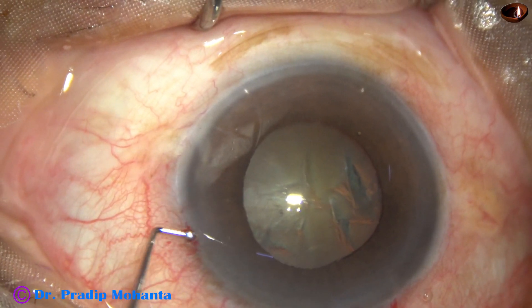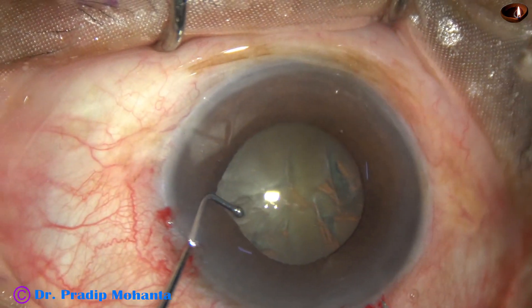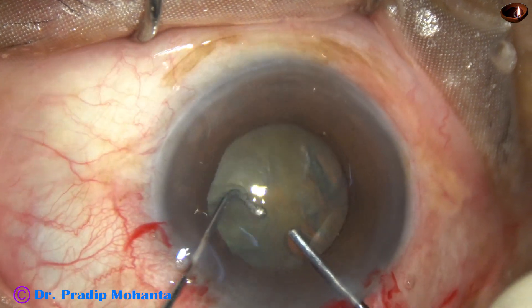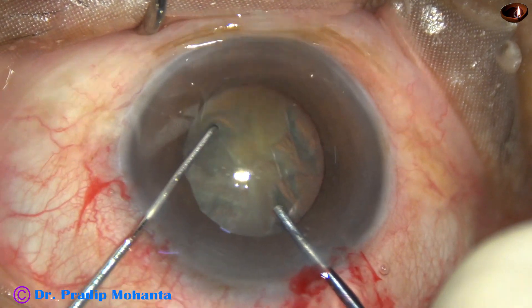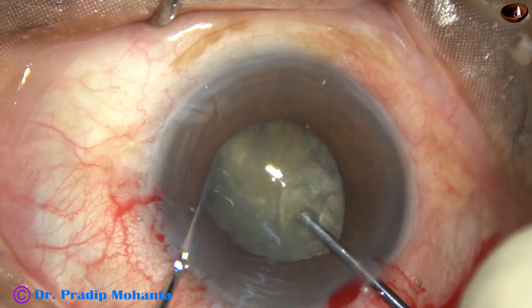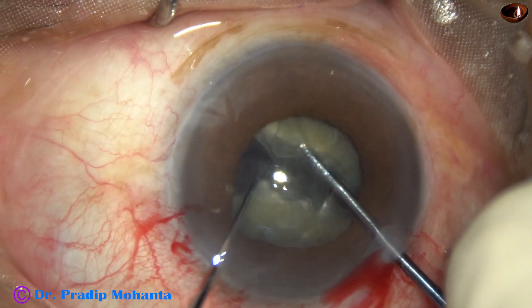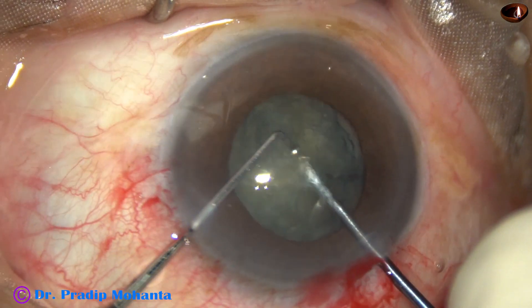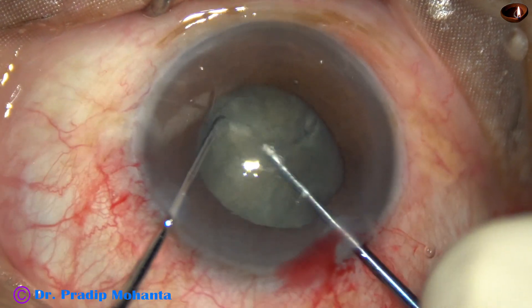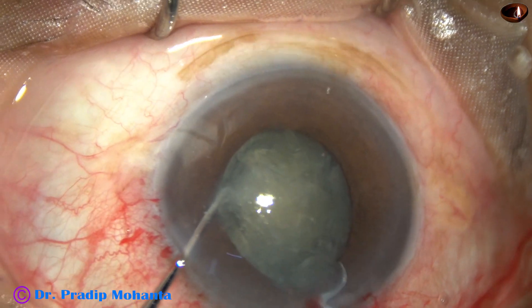Optimum amount of visco is injected. And now, I am using this pre-chopper to divide the nucleus into pieces. In the left hand is a sustainer — it is a ball-tipped chopper or sustainer. And now, one hemi-nucleus is chopped. This is a real-time, totally unedited recording — you are not missing anything.